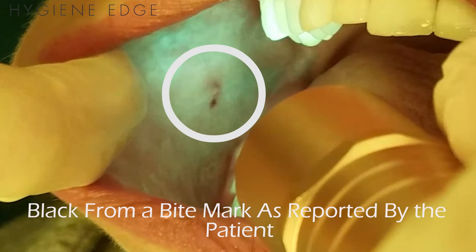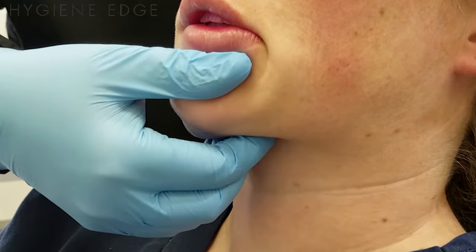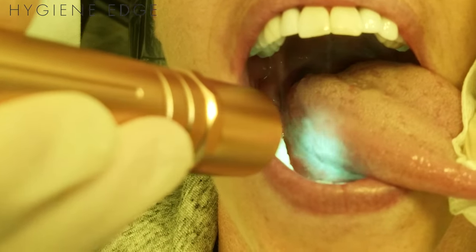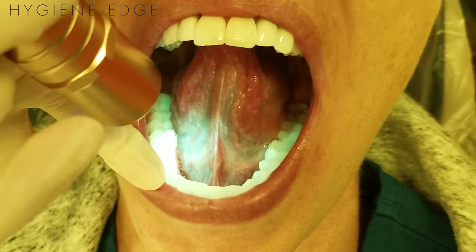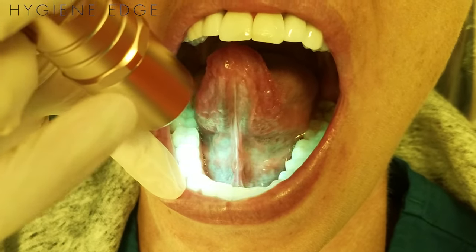To begin, perform a standard intra and extra oral palpation screening, then use the Oral-ID. Shine the light onto the patient's soft tissues, and don't forget to pull the tongue out with gauze and check the lateral borders, as well as the ventral and dorsal surfaces of the tongue and the back of the throat, as those are tricky spots for both clinicians and patients to see.